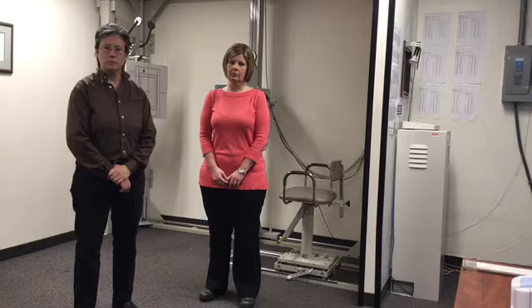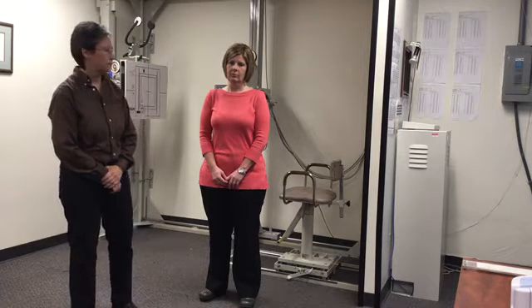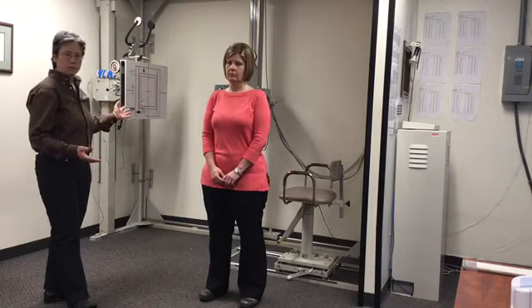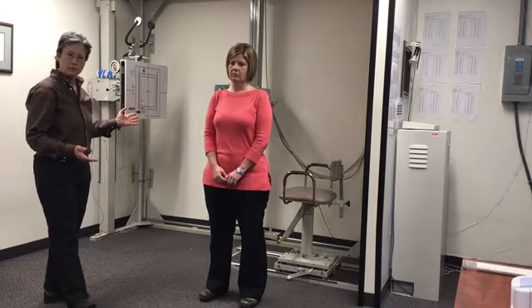This is the positioning of a patient for a swimmer's lateral using the Yochum and Rowe method. It's very similar to the Marchiori with some subtle differences that you'll need to know for national boards. So we're going to leave all the other steps the same as they would have been for the Marchiori.